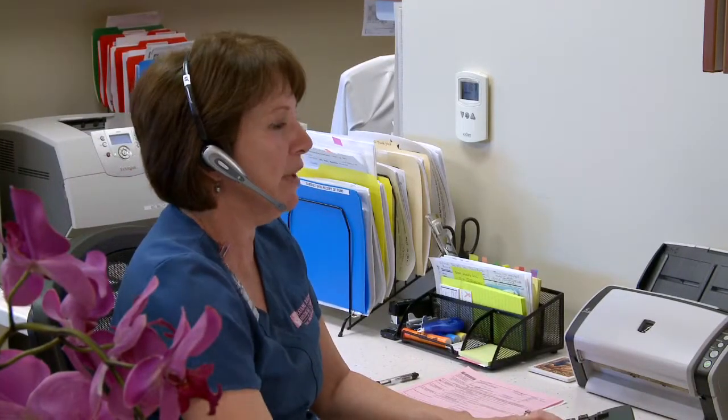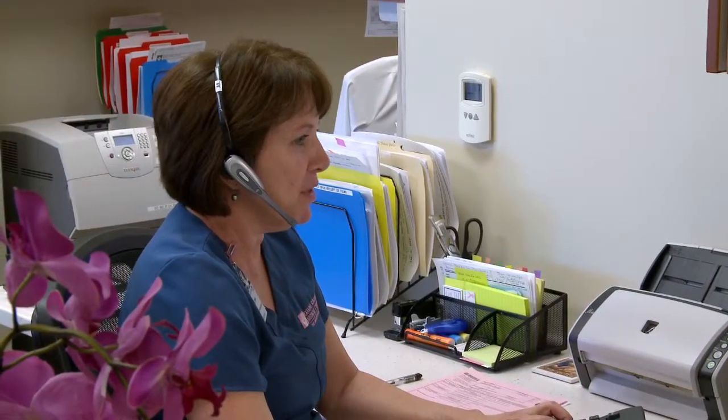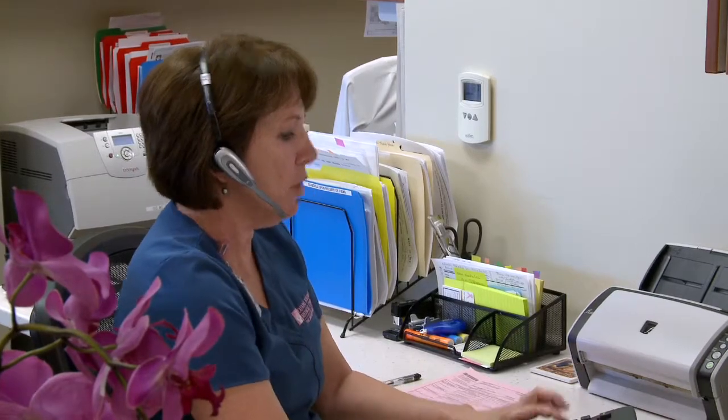For any woman who's gone through routine screening, I don't think we breathe a sigh of relief until you either get the letter in the mail or the phone call that the imaging is normal. When our schedulers call somebody for a callback to come in and get additional imaging, it's very anxiety provoking. Up to 20% of patients do get called back for additional imaging, oftentimes for alternate views, simply to confirm that everything's okay.